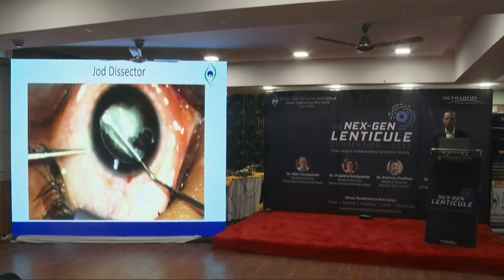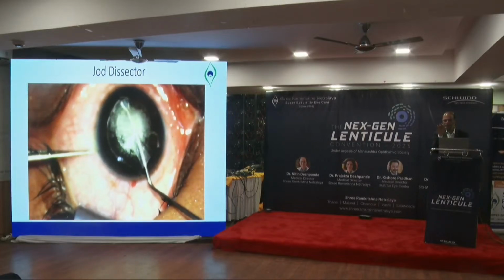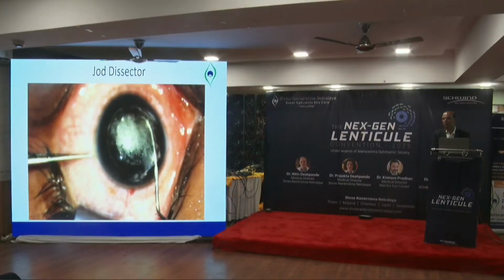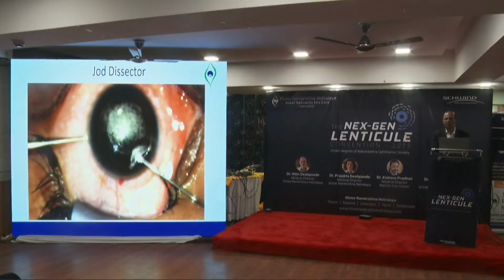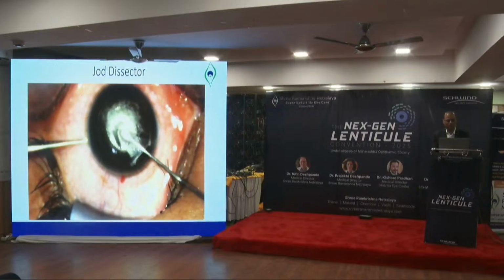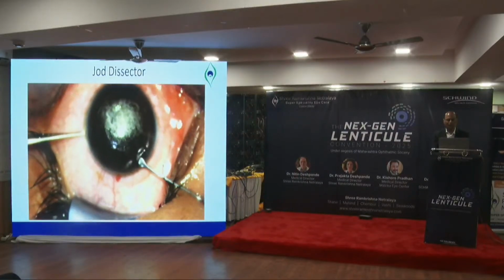With experience, you basically have to follow the edge of the lenticule. With experience, you know exactly where you are, by the clarity of the instrument that you are seeing below the cornea. If you are anterior, you see the instrument is a little clearer than when you are posterior. And then you see there is no resistance here. It's going smooth, all smooth. So I have done.